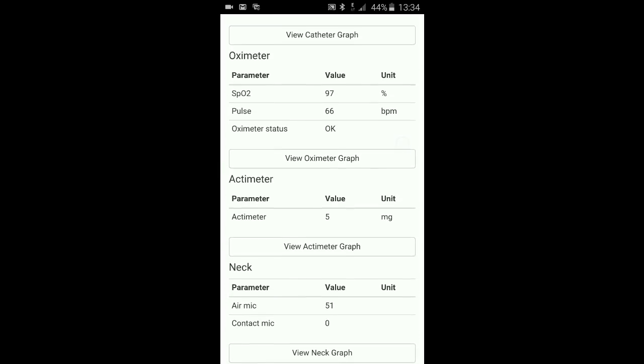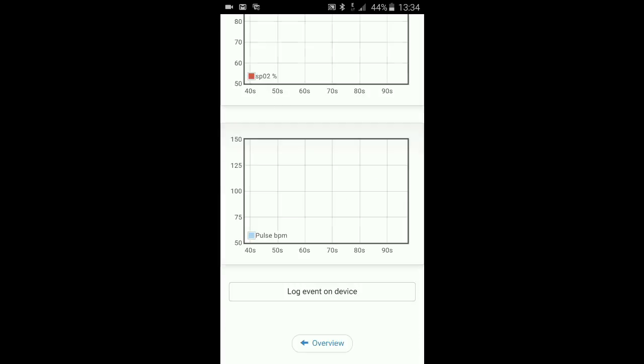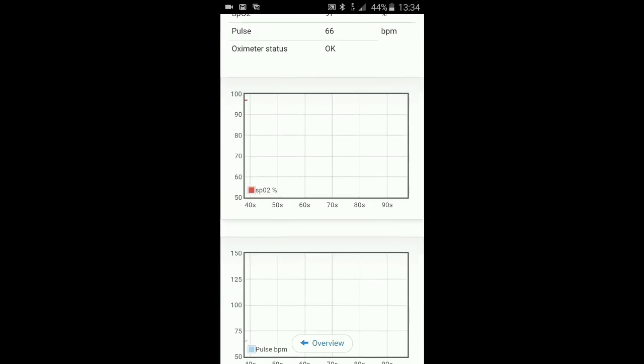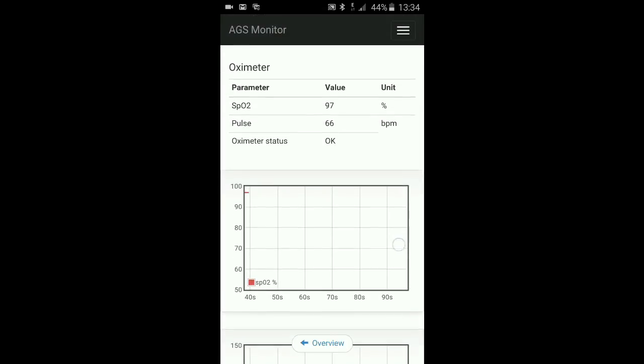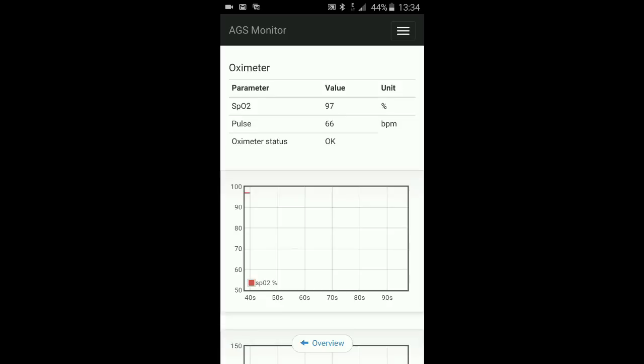Oximeter values. Graphical representation and numerical values. 97% saturation, 68 BPM pulse rate.